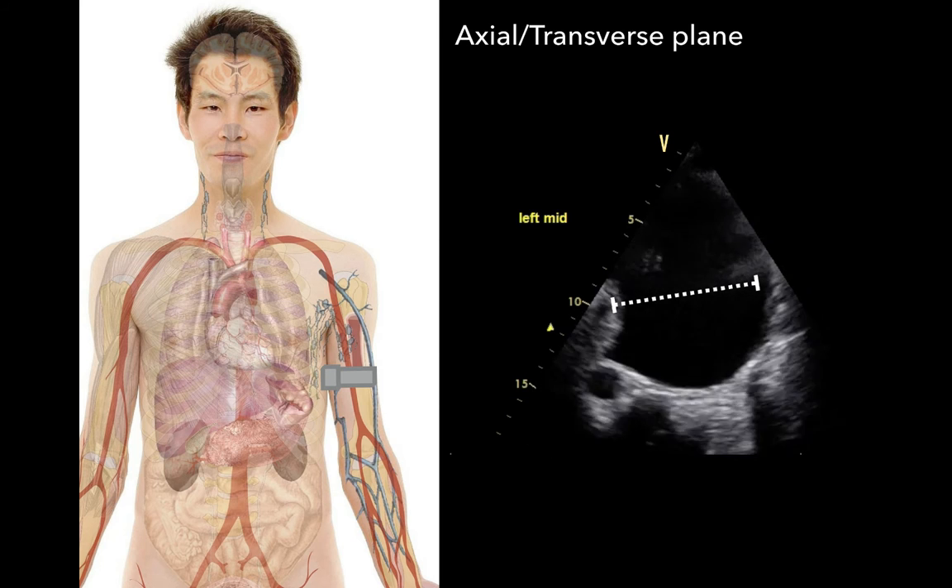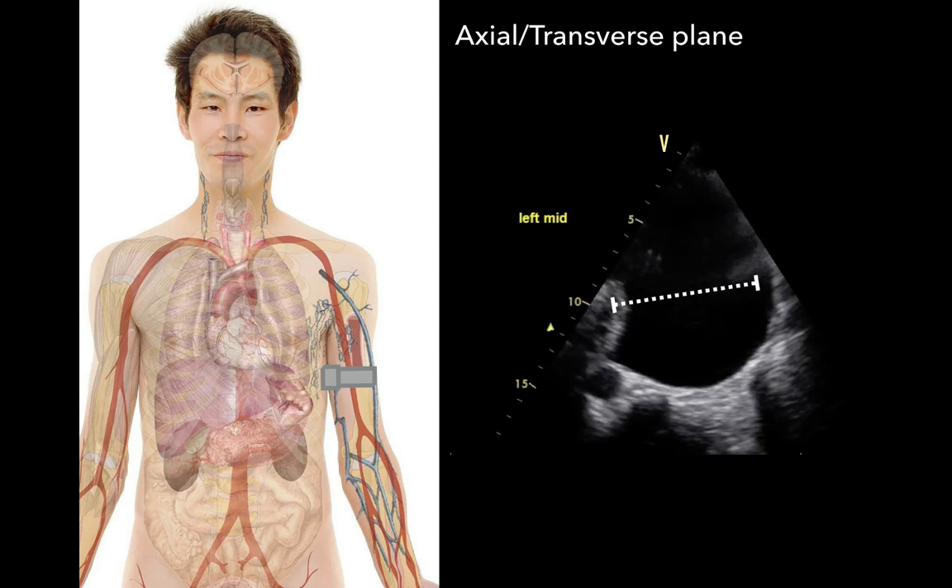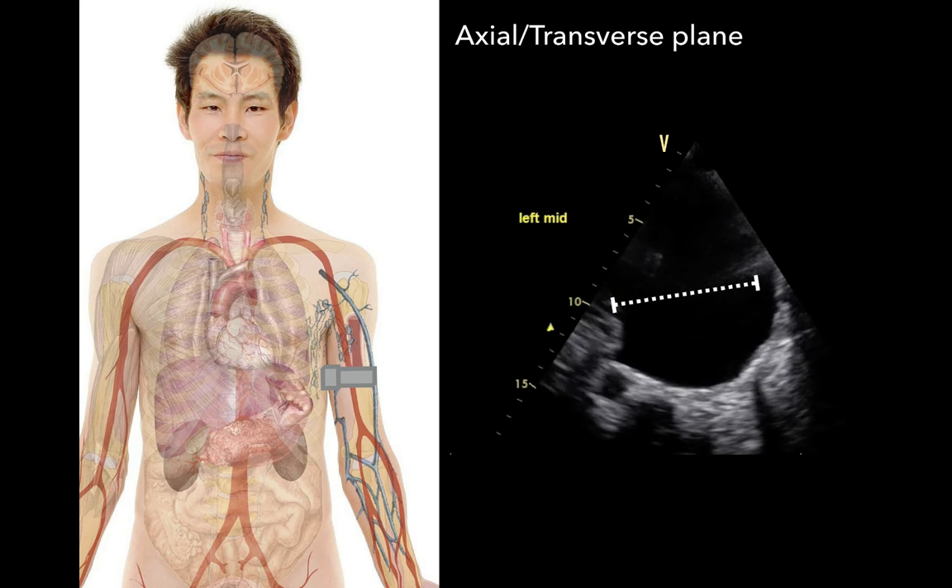You can slide the probe up and down the chest to get an adequate sense of the actual volume, and this approach makes it easier to determine a safe insertion site for, say, a pigtail drain — which can be quite challenging in the lateral thorax. Be mindful: if you're using this to decide on an insertion point, make sure your spot is not just a single thin slice of fluid. Keep the probe in the same intercostal space and angulate back and forth to confirm fluid in multiple directions, so that if your angle isn't perfectly straight, you still have space to safely enter the pleural cavity.